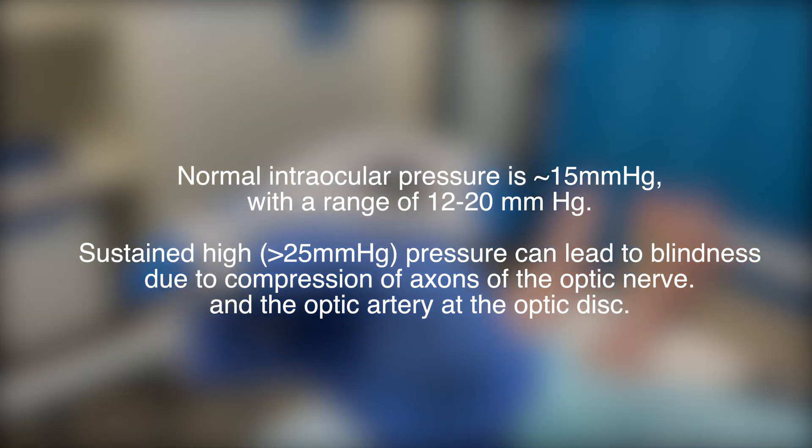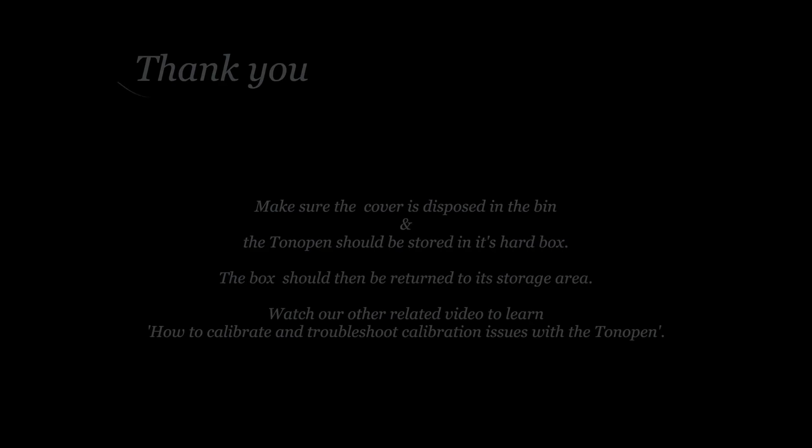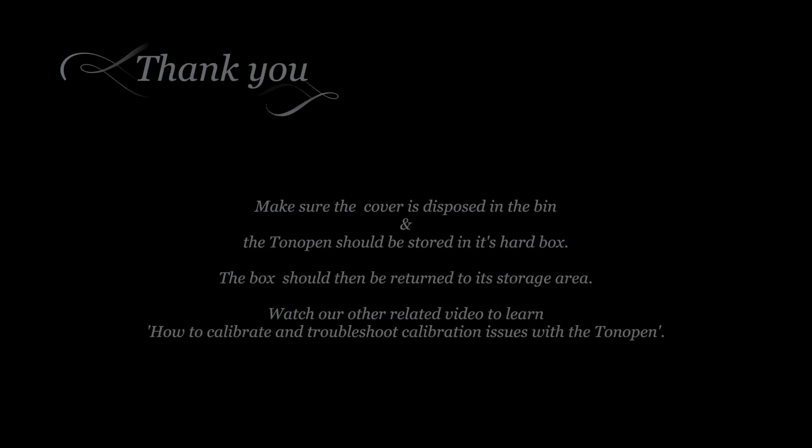The normal intraocular pressure range is between 12 and 20mm of mercury. Finally, please remove the used probe cover and safely return the tonometer pen to its storage area.